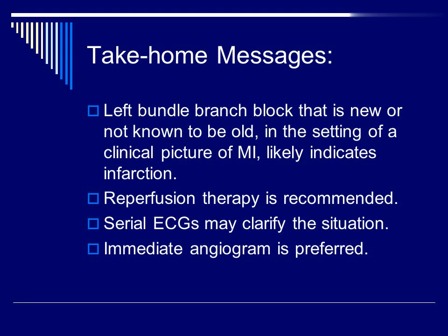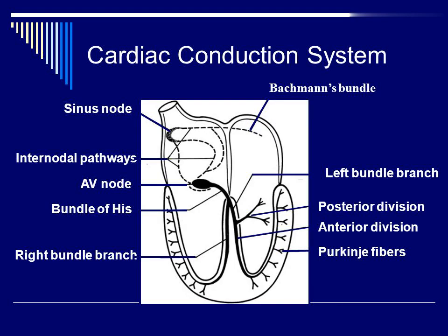Left bundle branch block that is new or not known to be old, in the setting of a clinical picture of MI, likely indicates infarction. Reperfusion therapy is recommended. Serial ECGs may clarify the situation. Immediate angiogram is preferred.